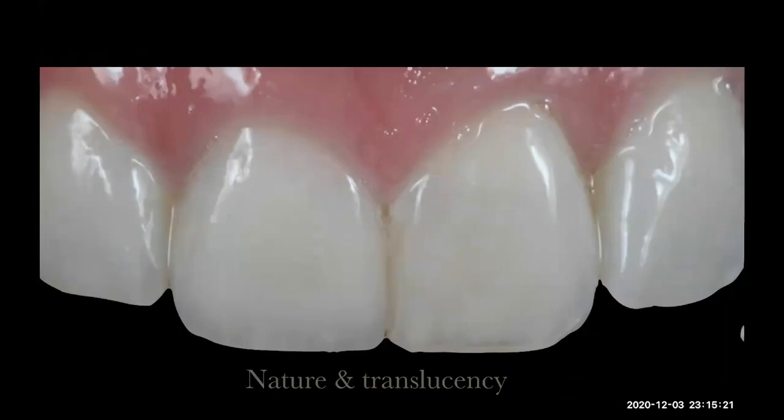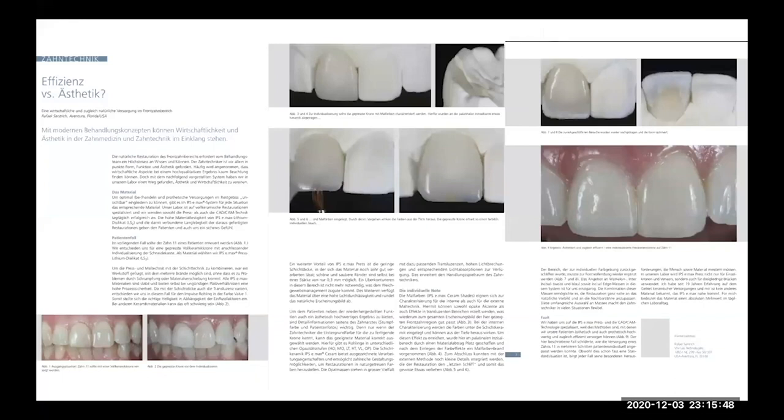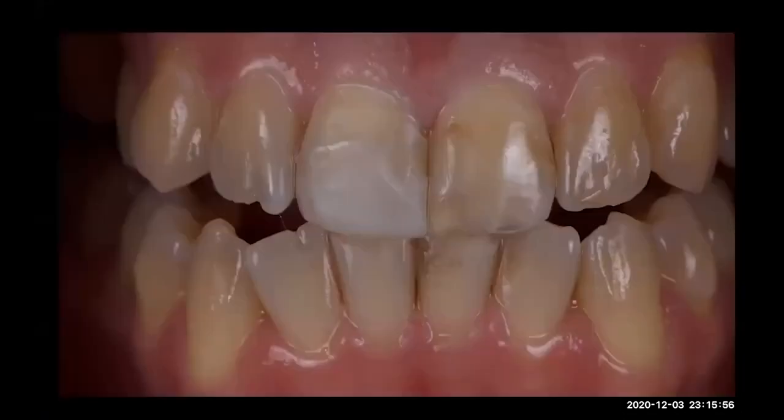2-3 months later. You guys need to understand that it's a 90% monolithic crown. We did only 5% or 6% of stratification. So it's really important to pick the right ingot and then do your nice wax-up, your nice texture, your nice technique. So Ivoclar helped me to publish that article in Germany. That was like 11 years ago. So we did that article.